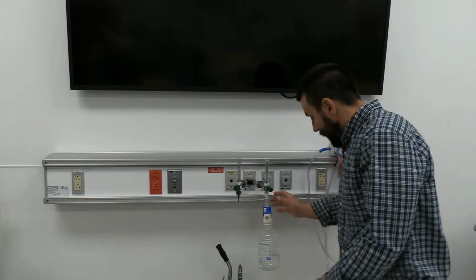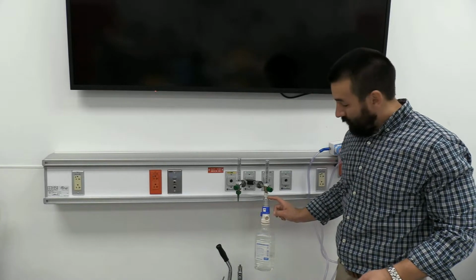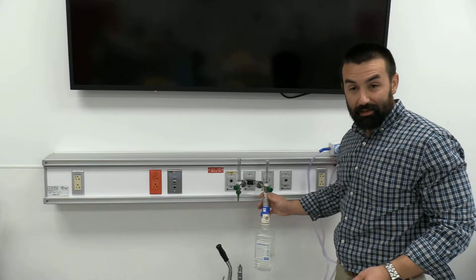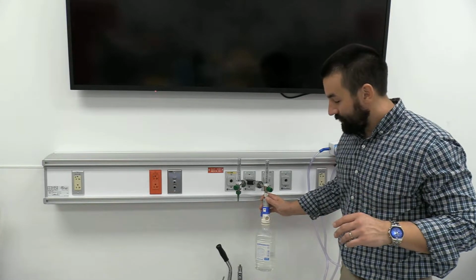All right, sorry about that. I had a little bit of equipment difficulty, so I went ahead and grabbed a different piece. Sometimes students are a little rough on things, and part of the piece of plastic that attaches all this was cracked in it, so I could tell by that sound that there was something going wrong.